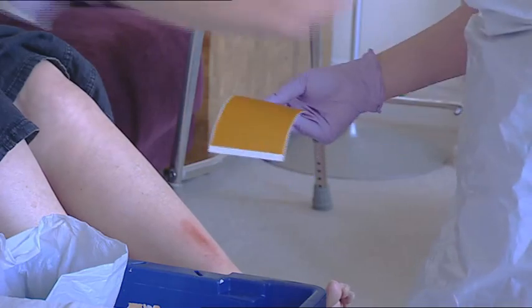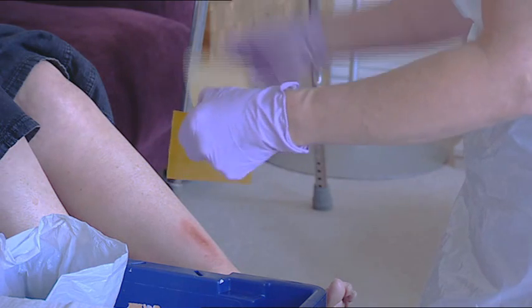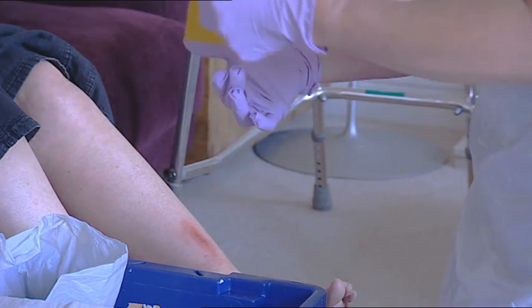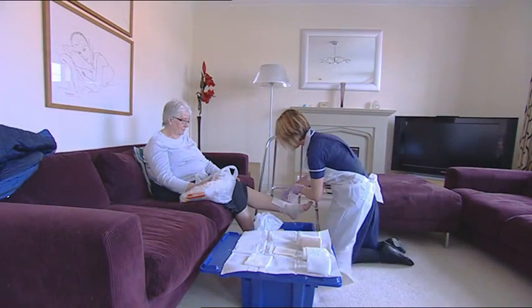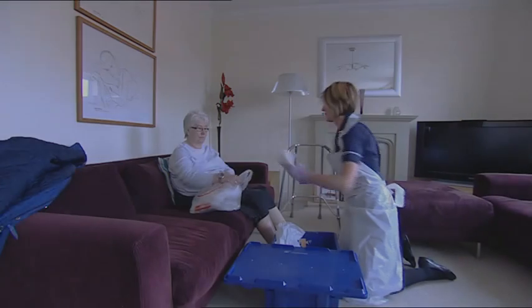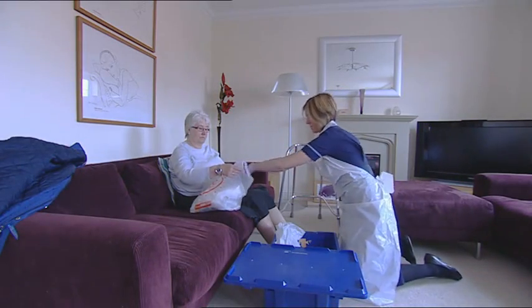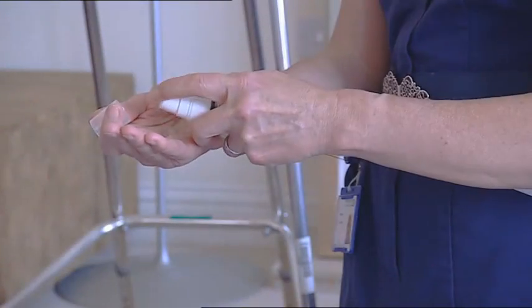Ensure that sterile dressings are picked up by the corners only, and when applying to the wound, that they're held by the side away from the wound surface. Make sure that you place all of the waste, including your apron and gloves, into the rubbish bag. This should then be disposed of following your Trust's waste policy.